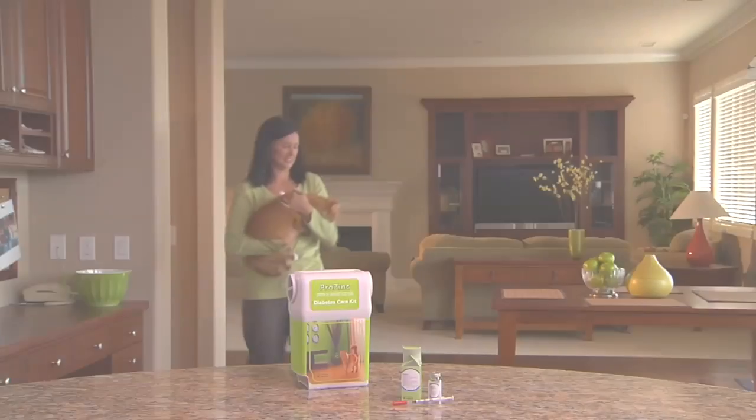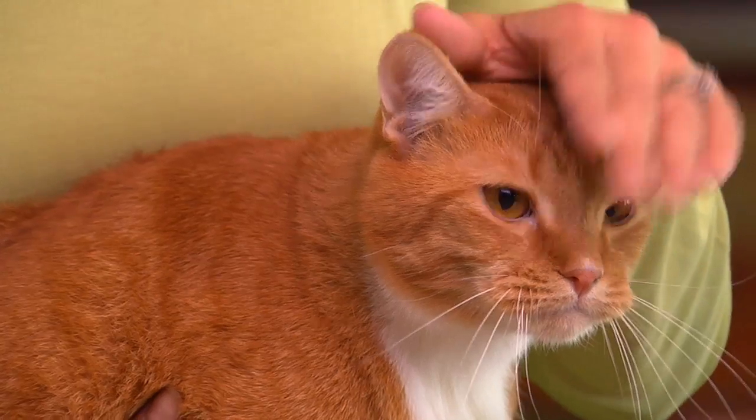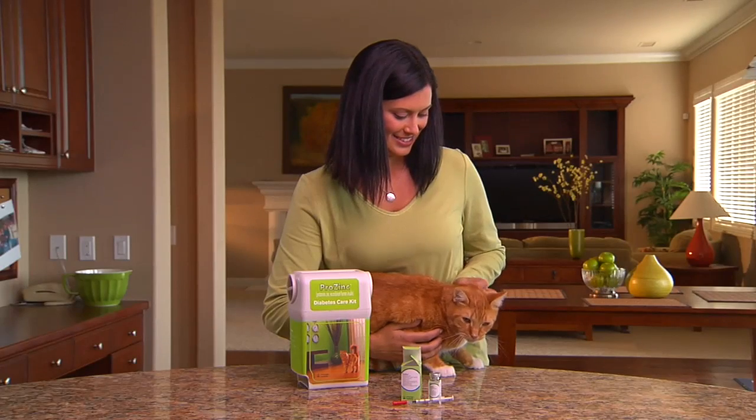Most people are a little nervous the first time they give the injection, but it's really not hard to do. We'll visit Lisa and her diabetic cat, Frankie, to watch how it's done. When you're ready to give the injection, place your cat on a stable surface and take a moment to pet your cat before you begin. The injection will be easiest if both of you are calm.